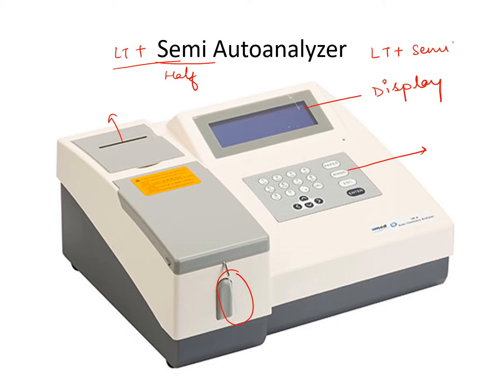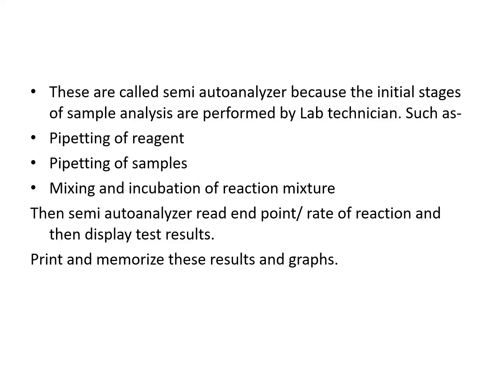So these are the parts of a semi-auto analyzer, and in a semi-auto analyzer half the function is done by the LT or lab technician and half is done by the machine. See, that's why these are called semi-auto analyzers, because the initial stages of sample analysis are performed by the lab technician.